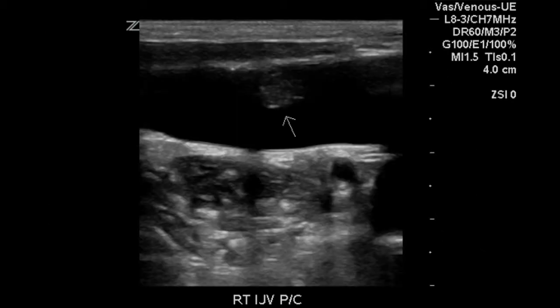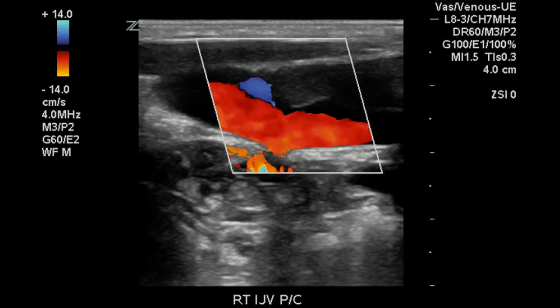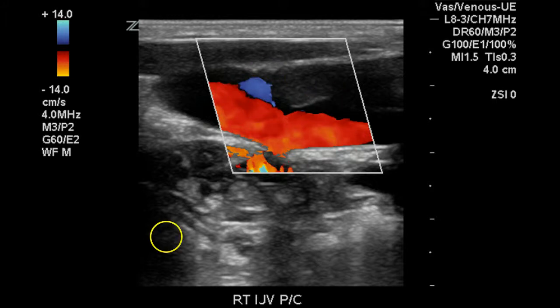This is a longitudinal image showing some of the thrombosis in the jugular vein. It has mild echogenicity and some irregularity to its surface. Another image, this with color Doppler, demonstrating thrombosis with an irregular surface.